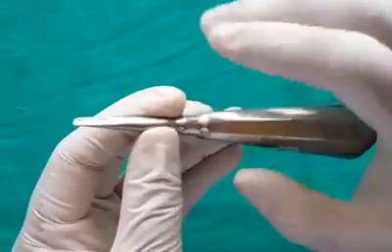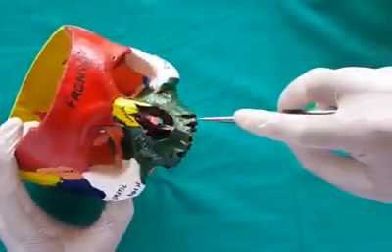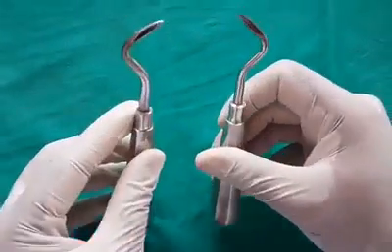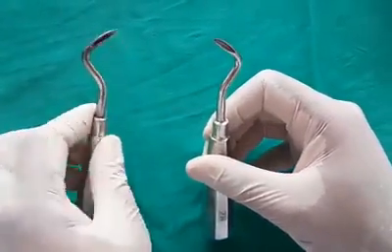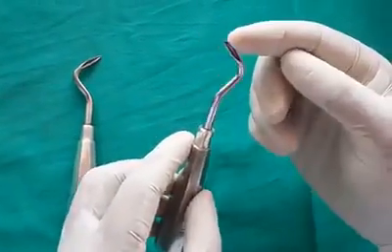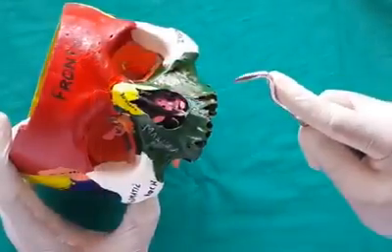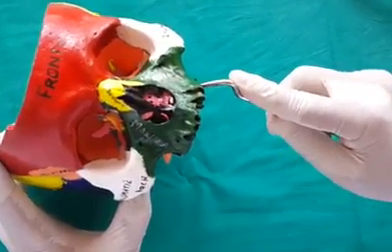Apexo elevators are a paired instrument, held in palm and thumb grasp. They are used for removal of fractured root tips or apices, and are primarily used on the wedge principle.